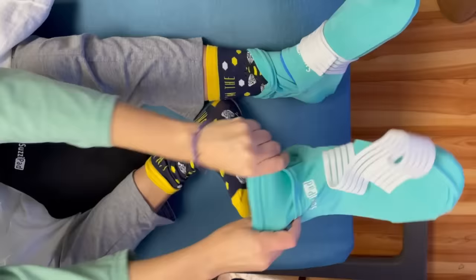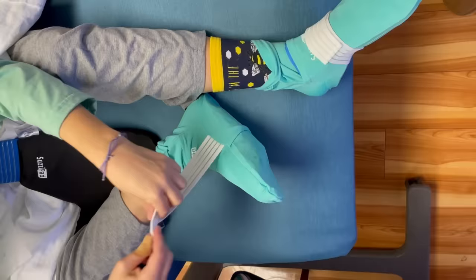If your infusion days are long like mine, you definitely want to have an extra replacement set of ice packs. I am now home, back in my chemo port shirt because we're heading back to the hospital to get my pump taken off. I would highly recommend getting a port shirt if you're going to be going through chemo because it makes it super easy to access your port and keeps me from having to think about what I'm going to put on for an infusion day — I just slip this on and it makes it super easy for nurses to access what they need.